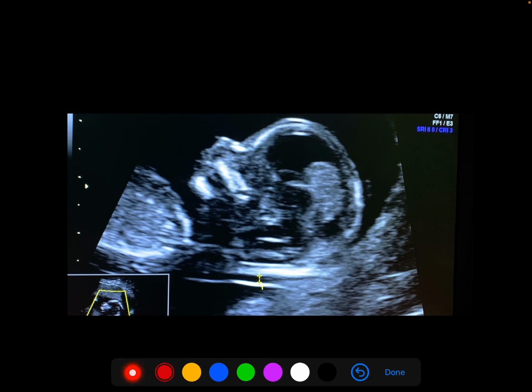What are they? First is the echogenic line is the skin surface, and below it is the nasal bone, which has to be present and also brighter than the skin surface, and anterior to both of them is the nasal tip. So these three structures should be seen to assess the nasal bone, and only if the nasal bone is more echogenic than the skin surface, then you can consider it as normal or present nasal bone.